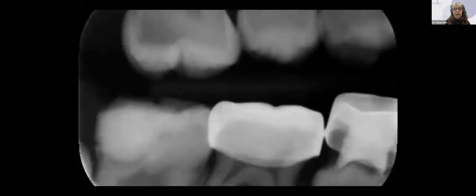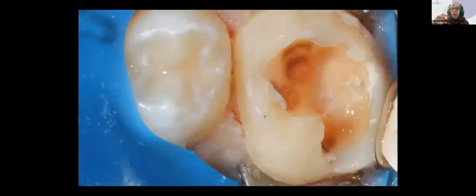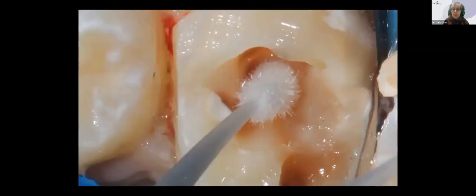So we have here in this radiograph, the upper 6-year molar. I would call that 16 here in Canada. You would probably call that tooth number 3, I think, in the States. And so preparation for a stainless steel crown. But I am concerned in this particular case, as we are in so many, that I would invade the pulp if I got out all of the decay. So I'm placing silver onto this tooth prior to the stainless steel crown to further arrest decay.